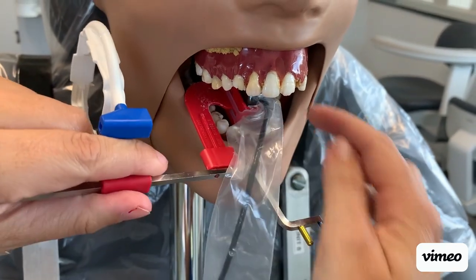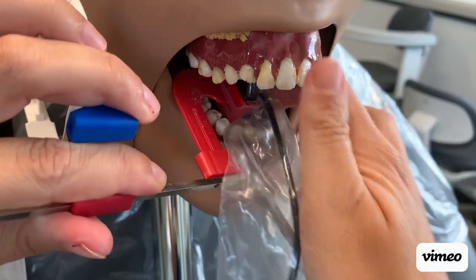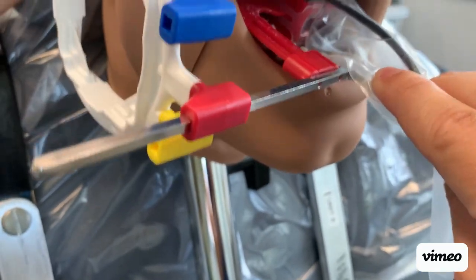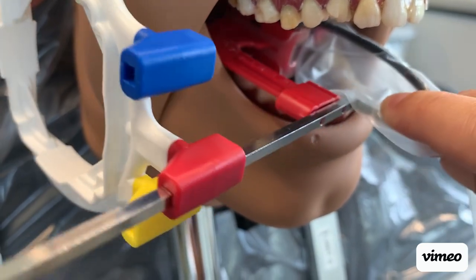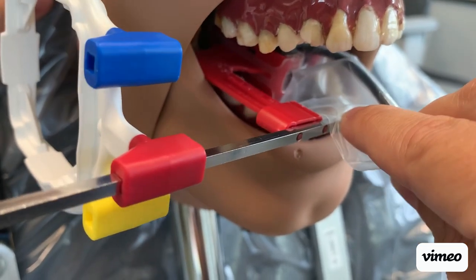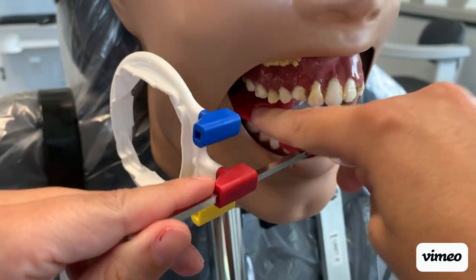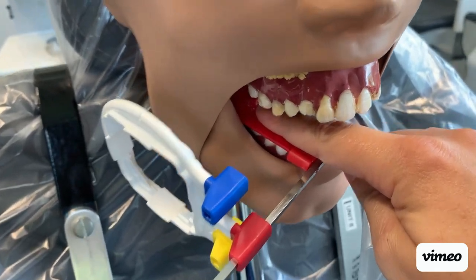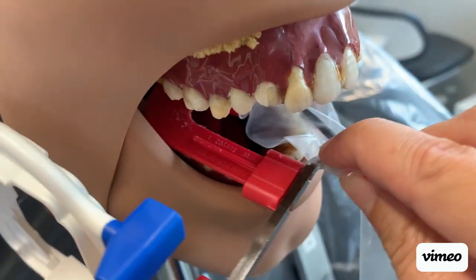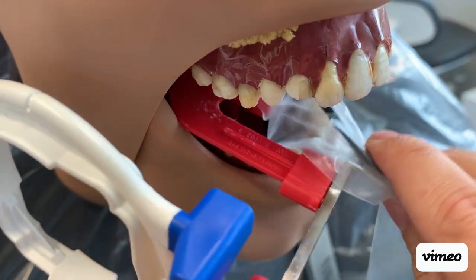Get the tongue out of the way and for your bite wings, set it on the mandible. The patient may have tori or other issues, but typically placing it on the mandible is your best option. Place it down on the teeth and set your horizontal — the receptor should be parallel with the teeth. Look at the bite block and confirm it is parallel with the teeth, because your bite block is parallel with the receptor. If the bite block is parallel, so is your receptor.